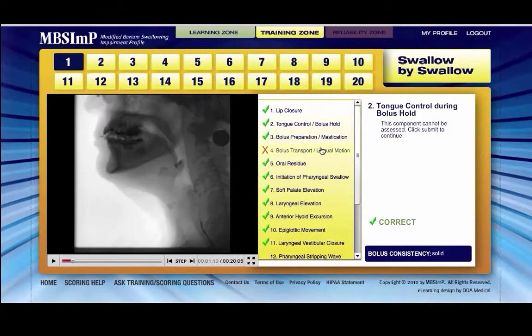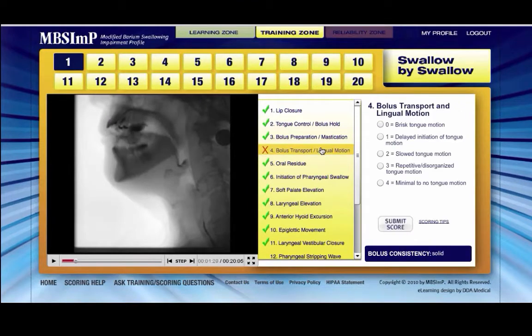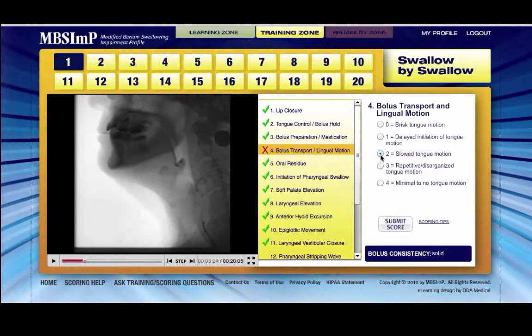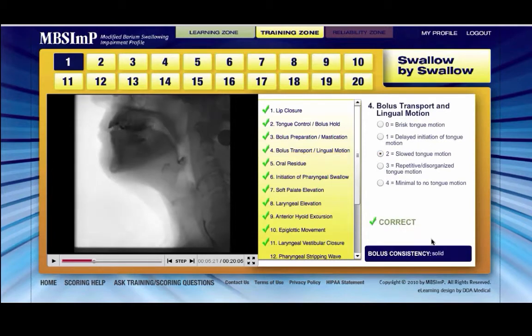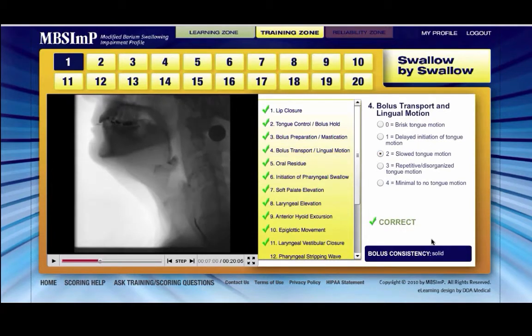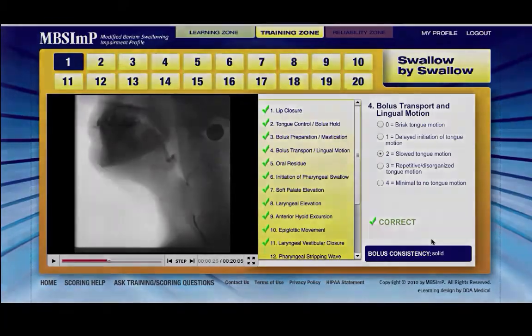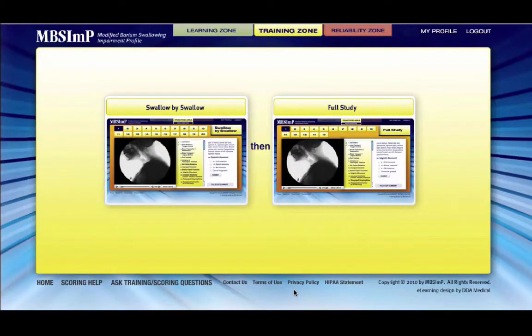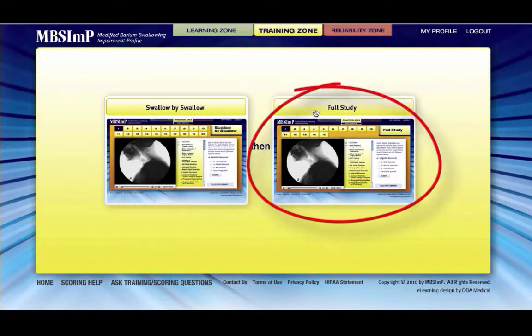Over the course of the training zone, scored components and the success of each are maintained and marked using a system of green checks and red Xs. The single swallow studies can be scored repeatedly, providing the opportunity for ample review, study, and practice before moving on to the full study section. Each must be scored at least once before access to the full studies within the training zone.